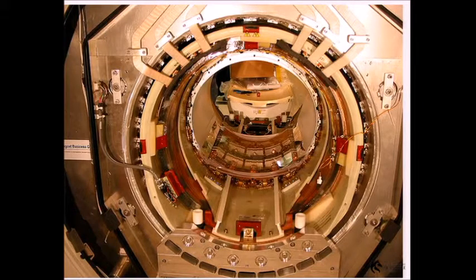They take that vessel and then superimpose their own hardware over the top of it. So what we can see here is this ring here is what we call the body coil. That's where RF transmission occurs for a lot of studies. And then you can start to see some electronics in here. So there's water cooling jackets, there's gradient coils, etc., etc.